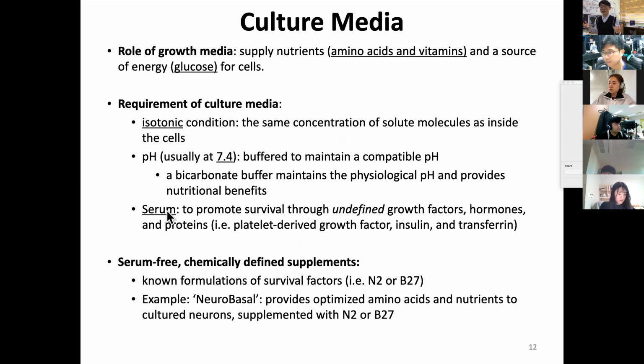The definition of serum is actually pretty easy. You draw blood, it's red, but if you centrifuge the red blood cells down, you have a yellowish liquid that we call blood plasma. But it contains clotting factors. By removing the clotting factors from the plasma, we call it serum.